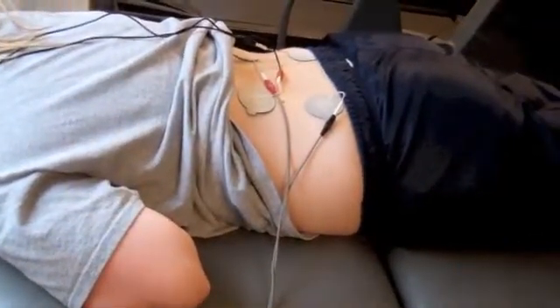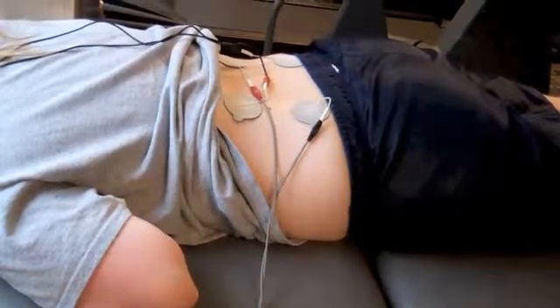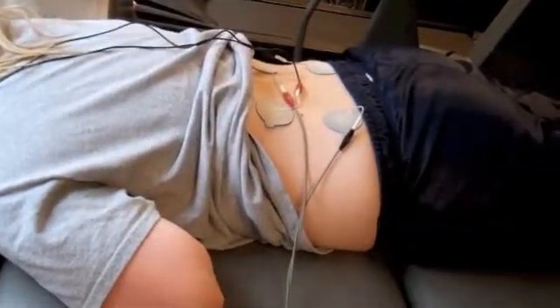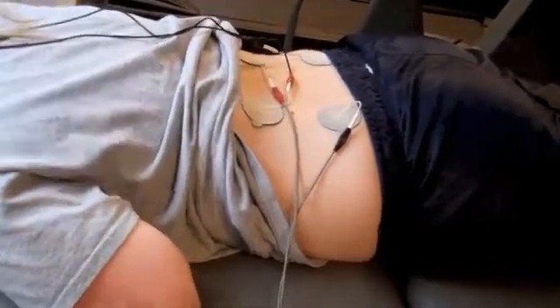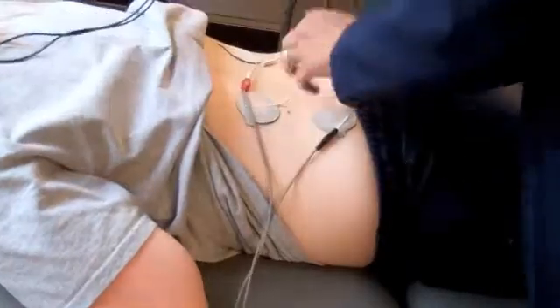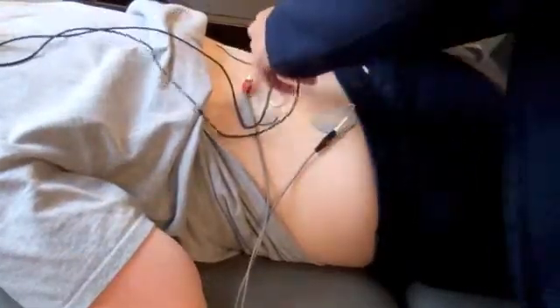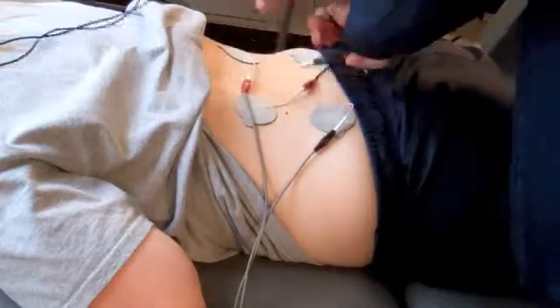All right, now we're going to demonstrate the use of IFC for sensory level or motor level pain control using the Intelect machine. So I'm just going to show a few differences. I'm not going to go through the whole thing, but just a reminder that we want 4 electrodes, and we need these crossing. So if we have lead 1 here, it needs to be hooked up to this electrode and then the one opposite. So this one, right?